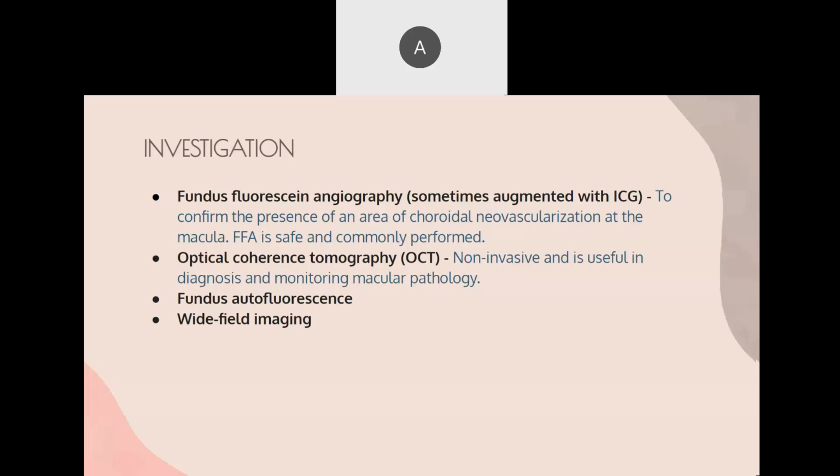So imagine we have a scanner there at the clinic. We can do a scan, we can see at the level of the nerve layer which level is affected and in which level the fluid accumulates. So OCT macula is a diagnostic test as well as used to see any progression. A very important tool in diagnosing a retinal disease such as macular degeneration. So number 1 is OCT macula.